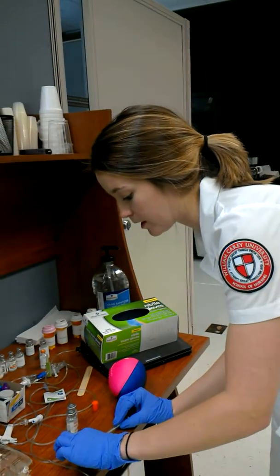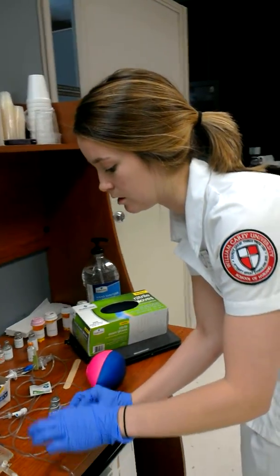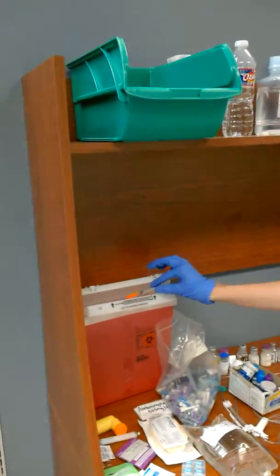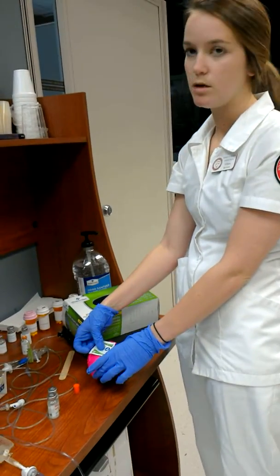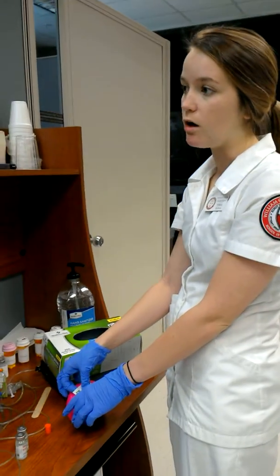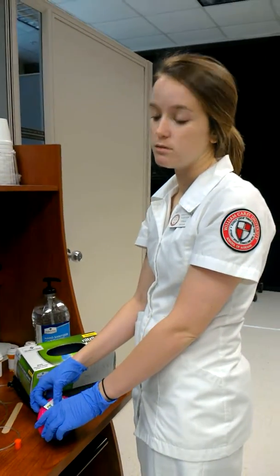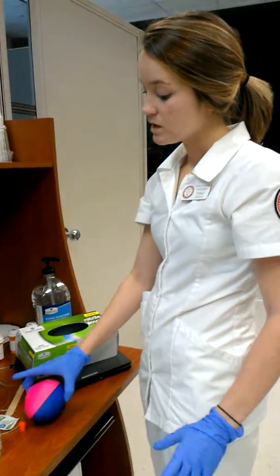I'm going to carefully put my cap back on. Go ahead and put it into the sharps container, and then take this alcohol swab and put it back on. Make sure that if there's any blood, to get the blood off, that the insulin isn't left on the skin or anything, and that's it.